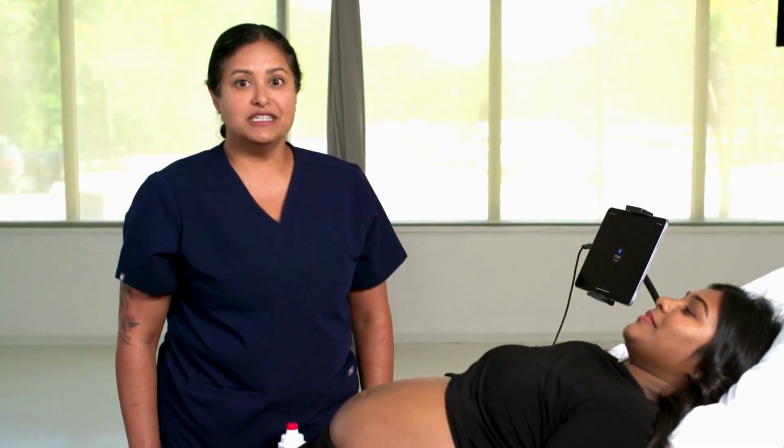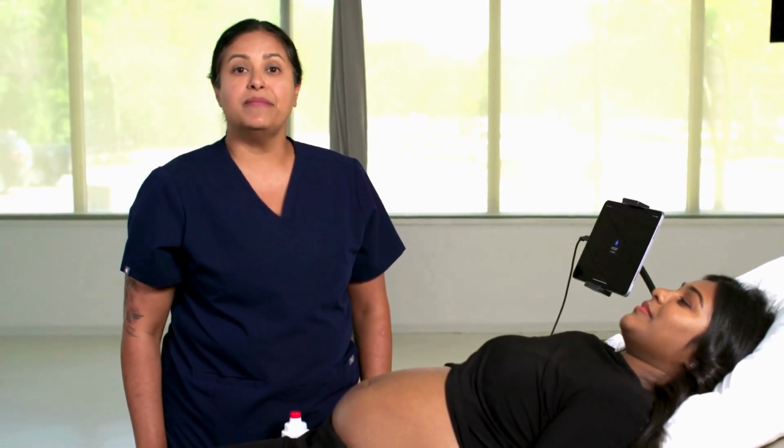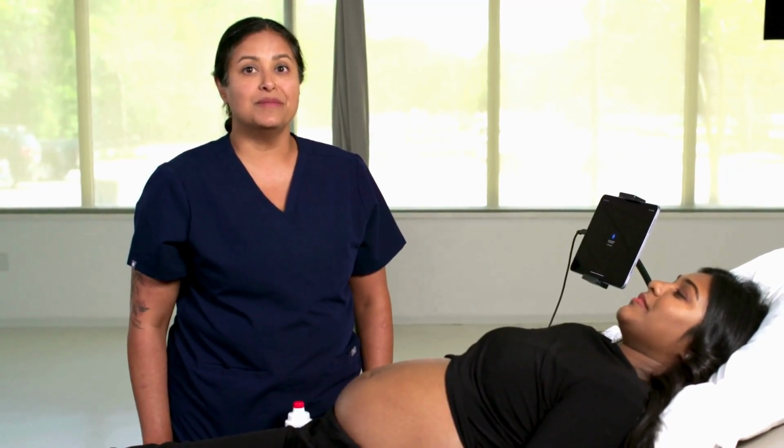It can be used by many levels of clinician in any scenario where the gestational age is not known, or for those cases when the patient is unable to provide that information. Knowing the gestational age is vital for clinicians to determine best diagnostic and treatment plans for pregnant patients.